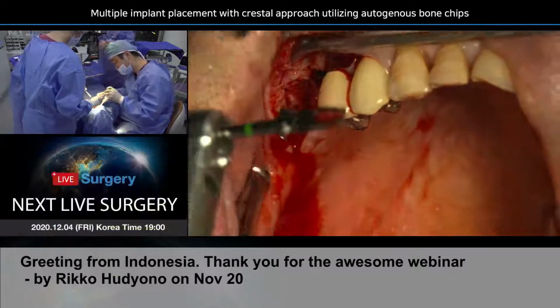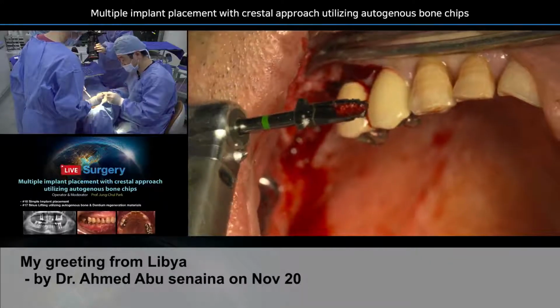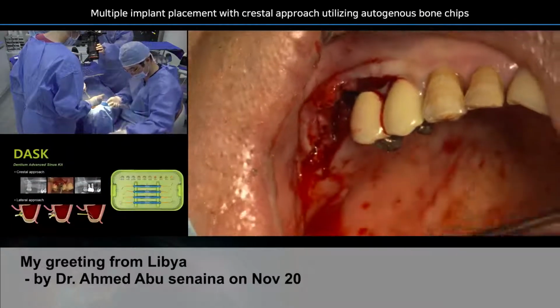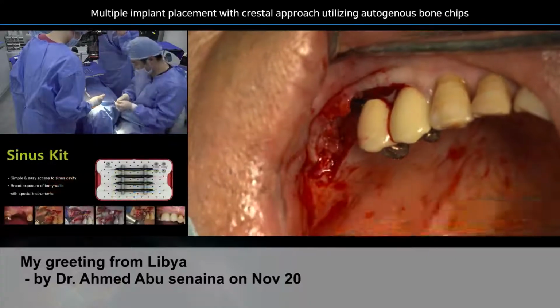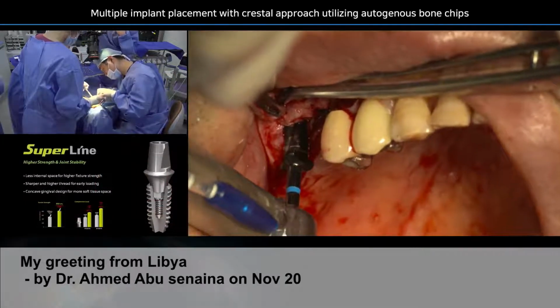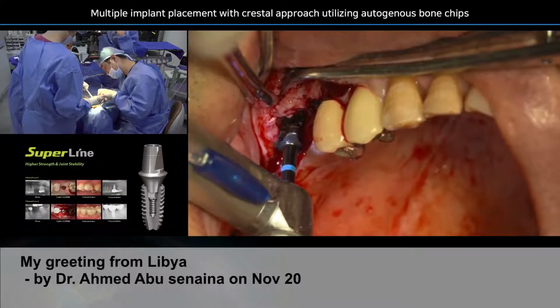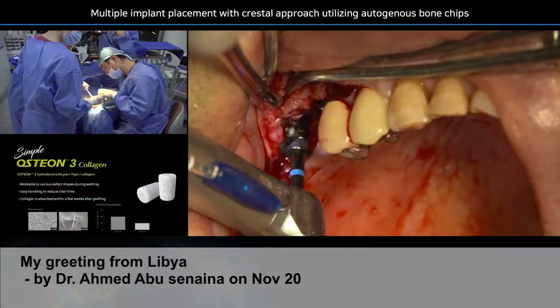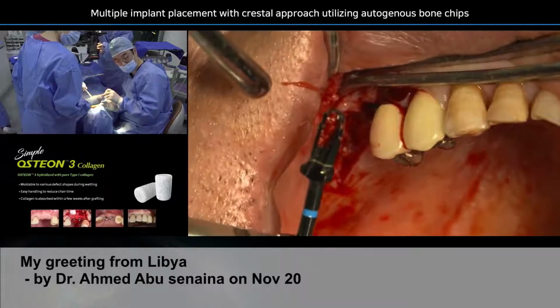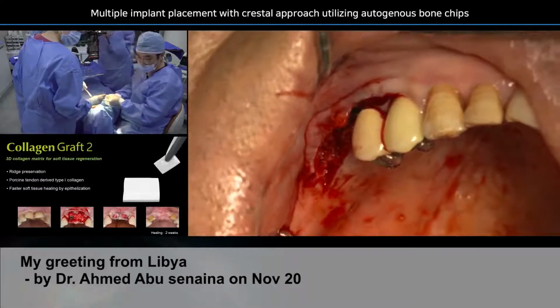Okay. Again, I'm collecting a little bit more autogenous bone captured inside the fluid of the drills. I take out my drill and I put it into saline again. And then already we are going on to the 4.5 millimeter final drill. Final drill again, very slow. And then slowly I rotate it and take it out. Additional autogenous bone, right? This is the autogenous bone. So I'm taking out the drills and putting them into the vials again.